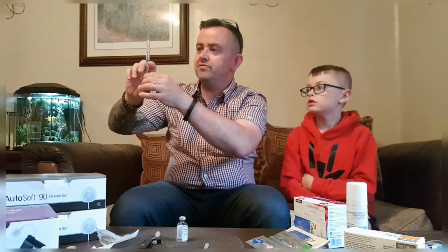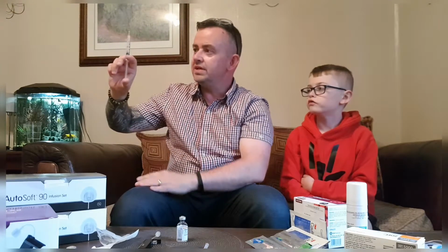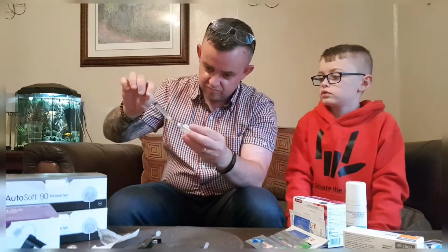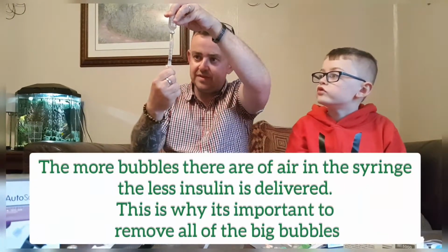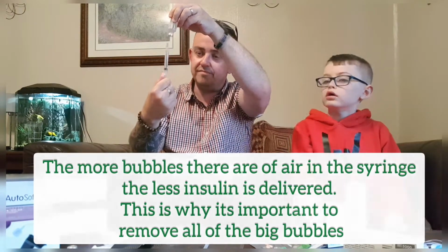So let's take that up. They're all coming out. It's air bubbles. It's air that's got stuck. So we need a bit more in there. Until I've got to 3 ml. That's BD, the brand of syringe.